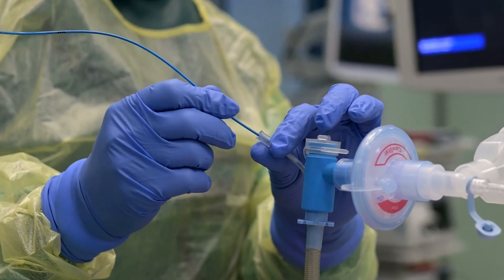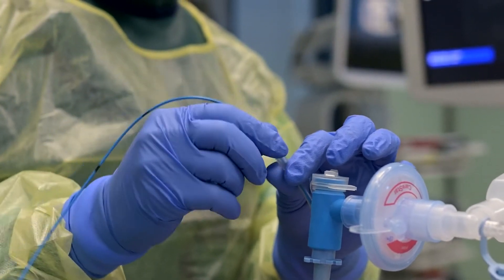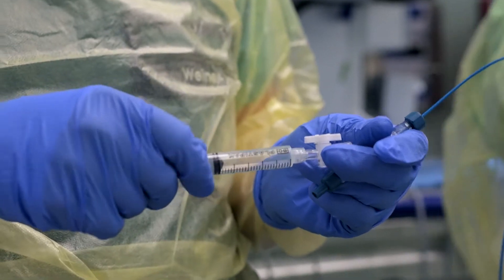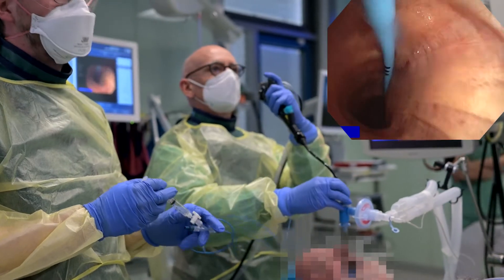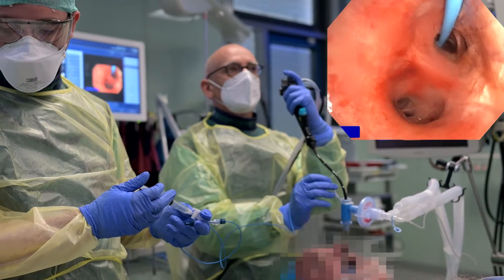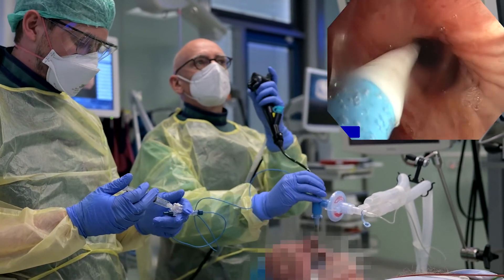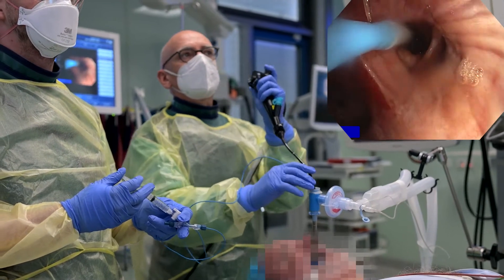The 6 French-gauge endobronchial blocker is inserted into the separate working channel of the ET tube. Moistening it with fluid can facilitate its insertion. After initial inflation, the balloon at the distal end might not fully return to its original shape, and this can complicate insertion through the narrow channel lumen. In case an ET tube without this separate channel is used, the endobronchial blocker may be passed through the glottis separately outside the ET tube lumen.